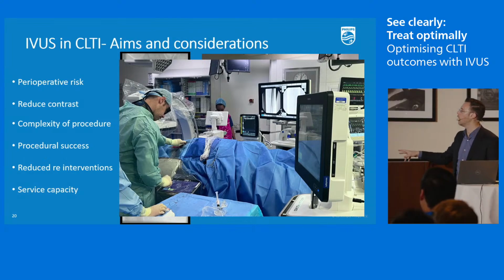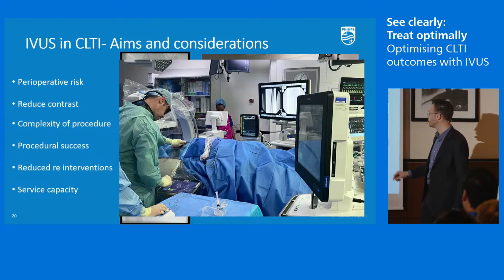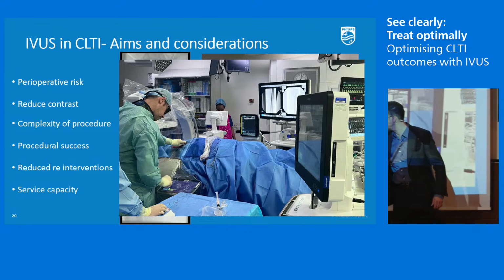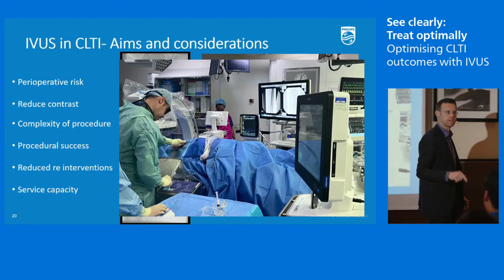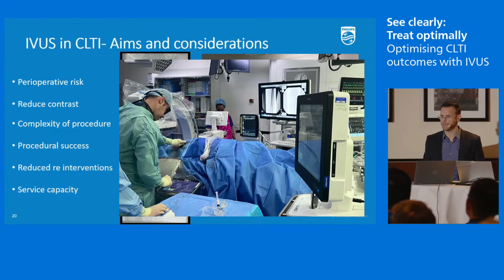This is how I set things up. I don't know how everyone else does. Maybe you'll see that from some of the other speakers. But essentially this is the IVUS machine. I have the transducer that is strapped to the side of the table and my touchpad here enabling me to do everything that would have required an assistant to do on the monitor there.